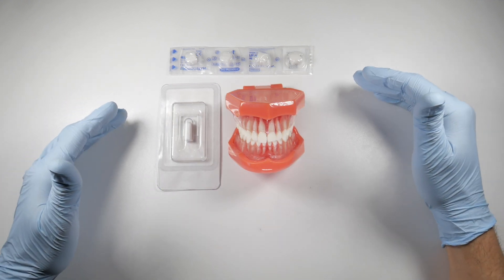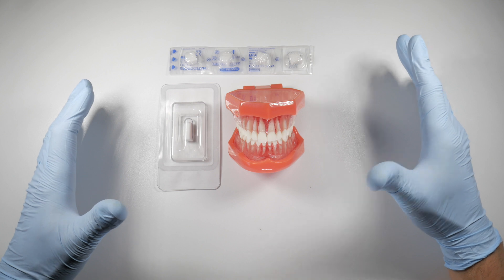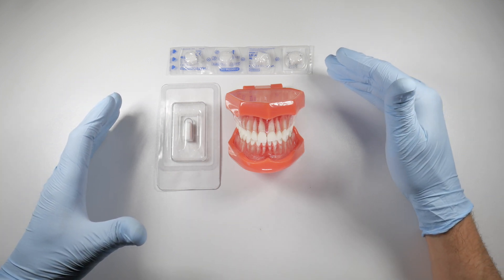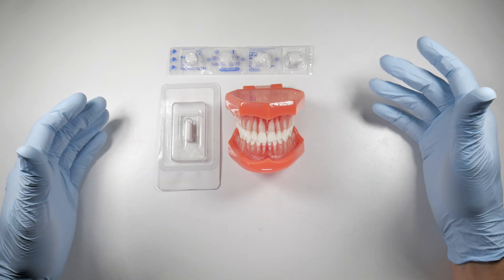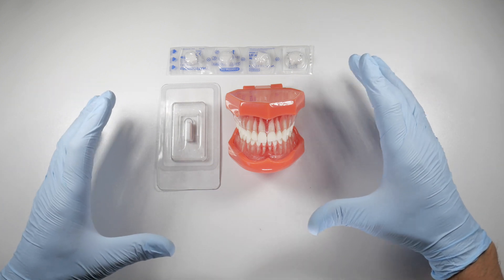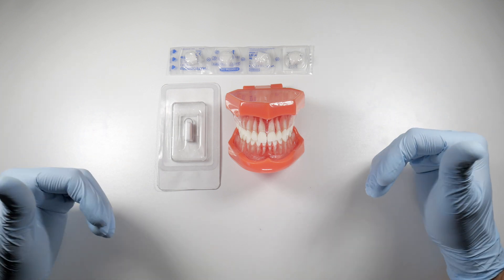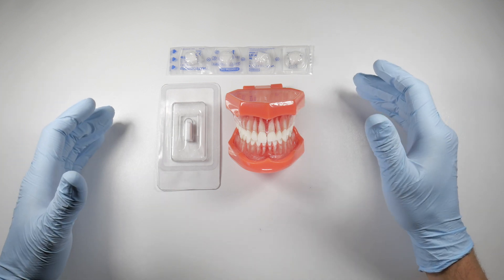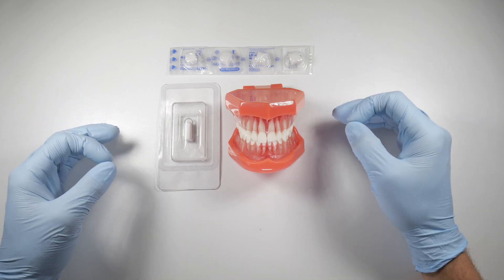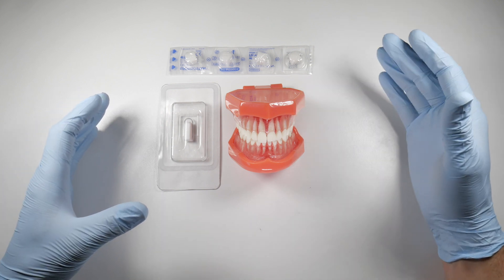Gel foam is interesting — the people who made it don't even fully understand how it works. They postulate that platelets enter the material and are slightly damaged, causing them to release chemicals that activate more platelets and help form that platelet plug. They also think it works largely because it can absorb a massive amount of fluid — up to 45 times its own weight in blood — acting as a super-absorbent sponge, with platelet activation as a secondary effect.